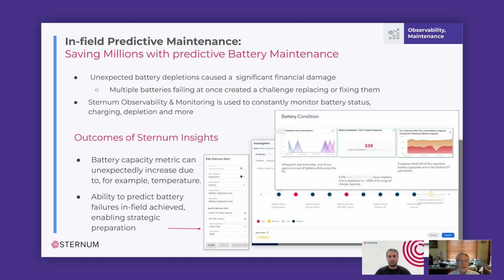And one of the things we want to know, for example, is how much has the full charge capacity depleted over time. We have targeted the battery to provide 3 hours of runtime. And as that full charge capacity drops, that runtime also drops. And our users would prefer to have the battery last all day.